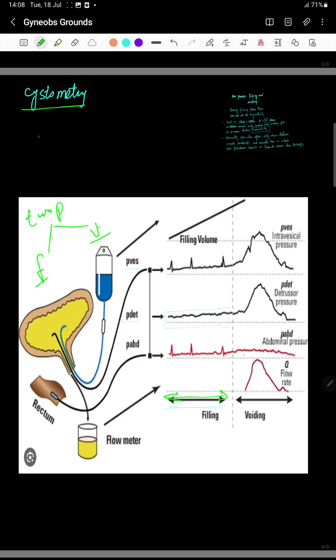During the voiding phase the abdominal pressure remains stable. The detrusor pressure remains stable throughout the entire filling phase — the detrusor muscles do not contract during the filling phase. If they do, it means there is abnormal overactivity of the detrusor muscle.